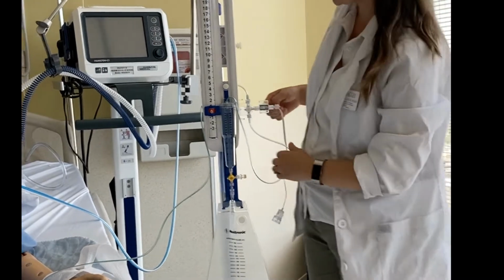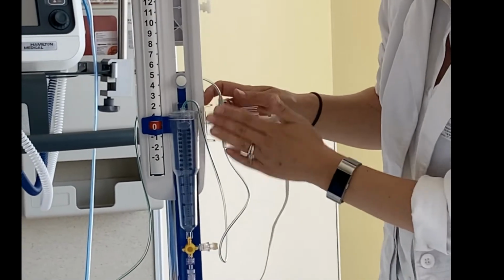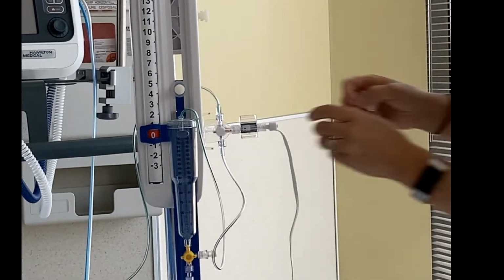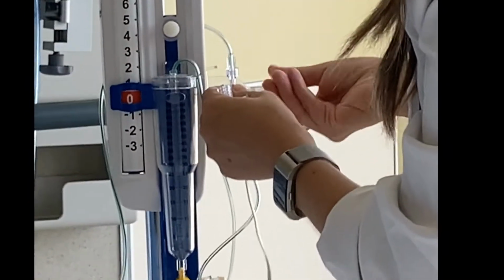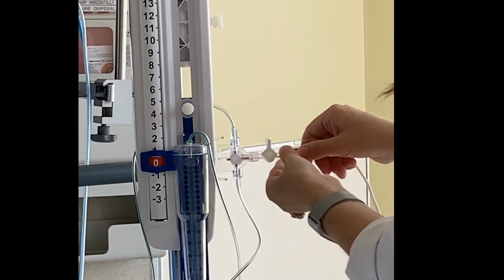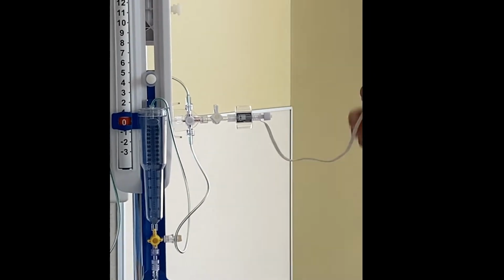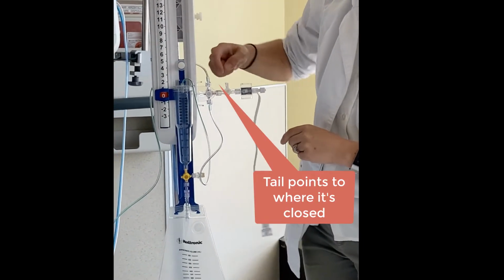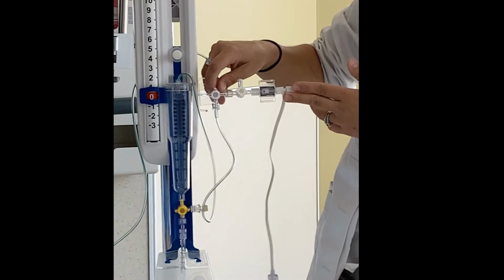Some other parts of the system that are useful for you to know are all the stopcocks here and here, and there is usually an additional stopcock that we put right over here between the transducer and the system itself, and you will see why. Okay. So this is your transducer. This will connect to the monitor so that we can measure our ICP. Okay, this is a 3-way stopcock, and right now it is open to the system, so the transducer can sense the pressure inside of the cranium.